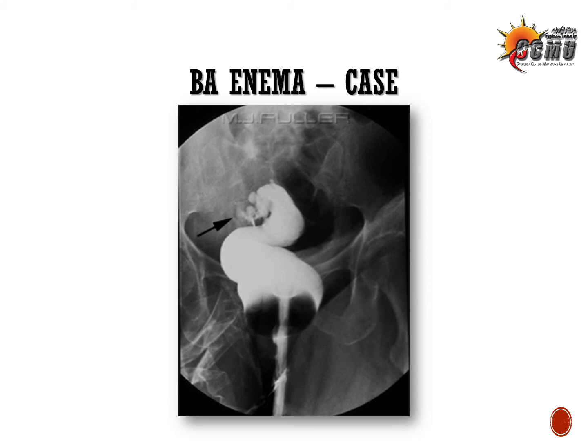So it's injected through the rectum, and the sigmoid is showing a proximal obstruction or arrest of the dye, so the barium cannot pass beyond the sigmoid mid part, or maybe the proximal part of the sigmoid.